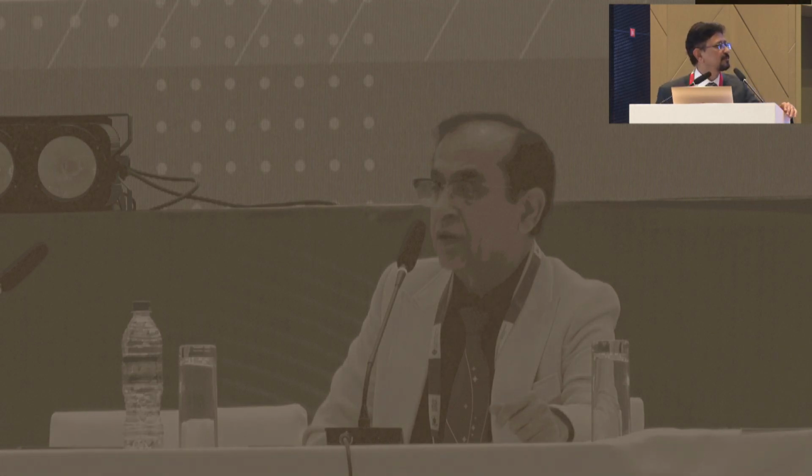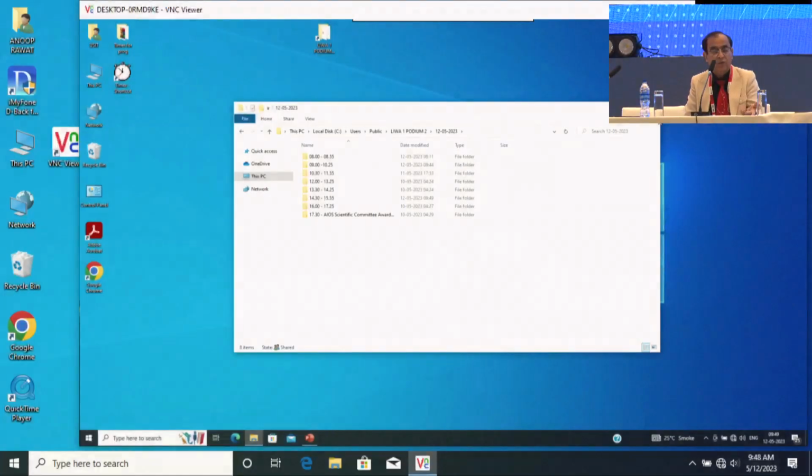Yes, that's true. We do. I mean, SICS is a good option in these cases wherein you have a dense opacity. Recently, I had one patient, very elderly, with a trabeculectomy operated eye, dense cataract, corneal opacity, just PL PR. The AC depth was just 2 mm. So I just went and did the ECCE. We wanted at least the patient should have whatever vision possible.